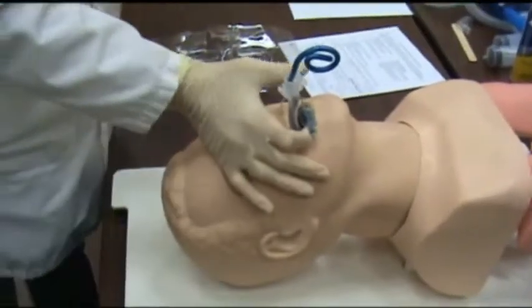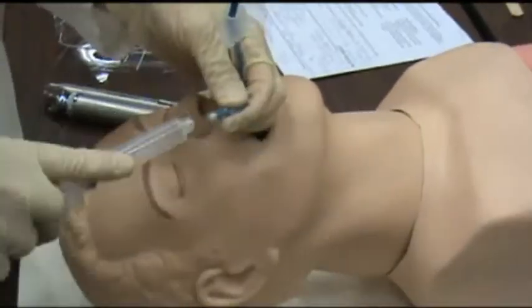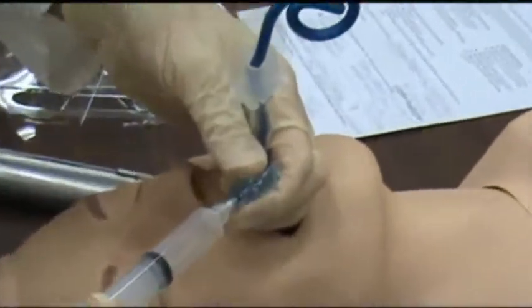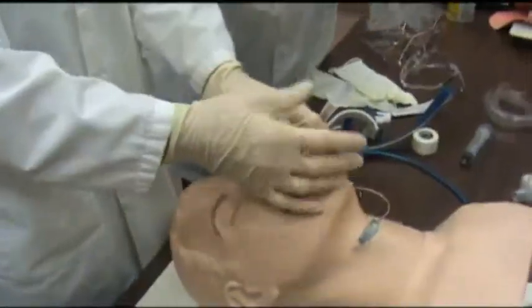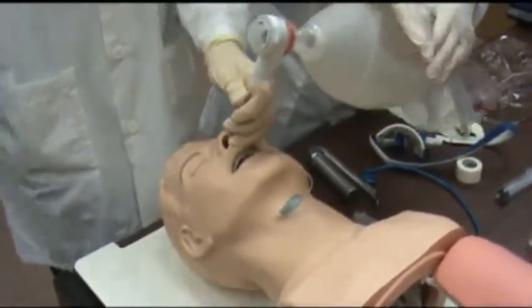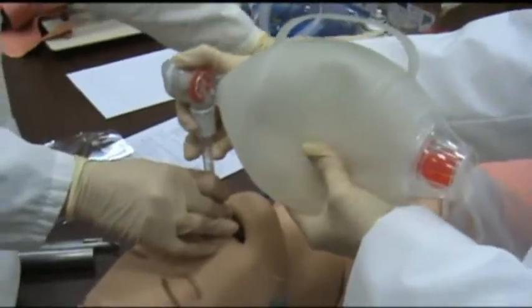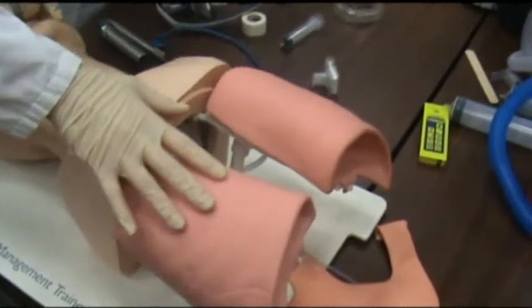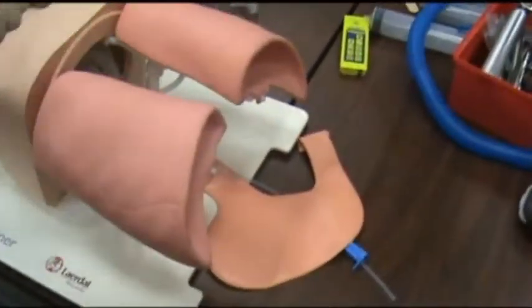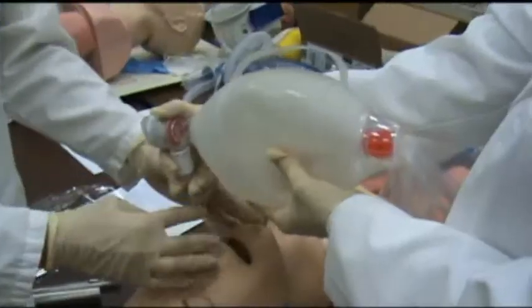Be careful not to put pressure on the teeth and be careful of their lips — do not rock back on the teeth. Inflate the cuff to just enough pressure so that the trachea is blocked off. Remove the stylet, then attach the bag valve mask. Once you have placed the tube, listen with your stethoscope over both the right and left lung fields to confirm equal bilateral chest rise and clear breath sounds. Also check over the stomach — if you hear gurgling, the tube is misplaced in the esophagus rather than the trachea. You can also look for condensation in the tubing to confirm correct placement.